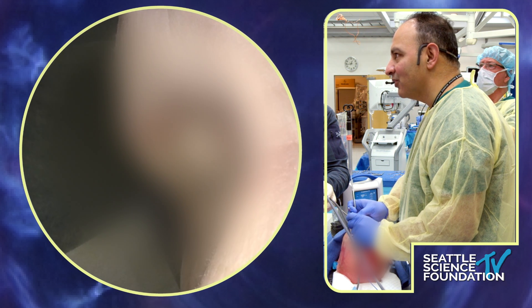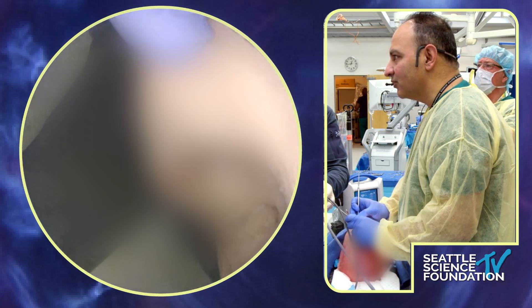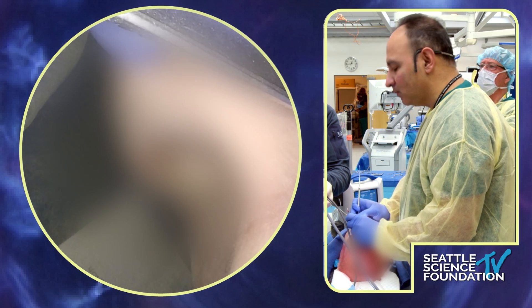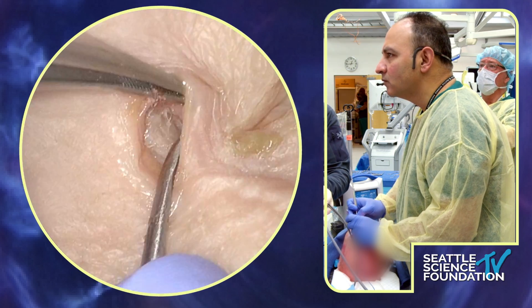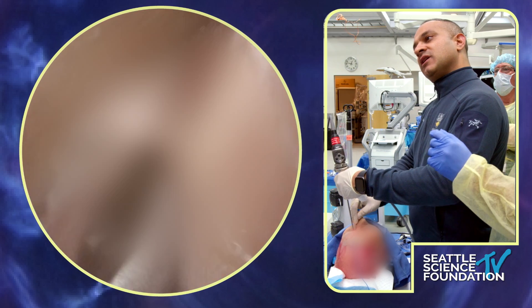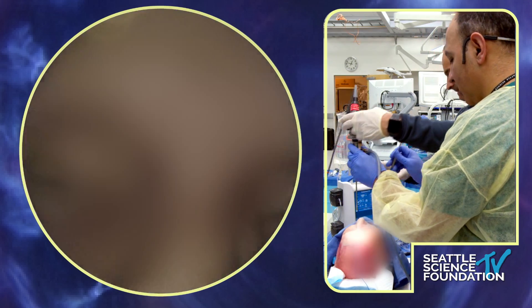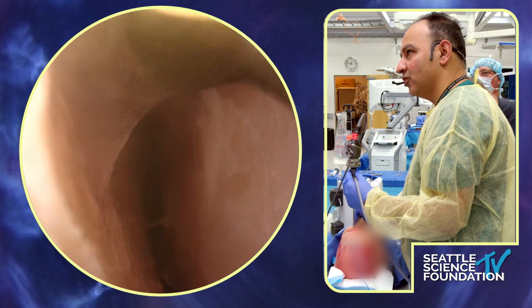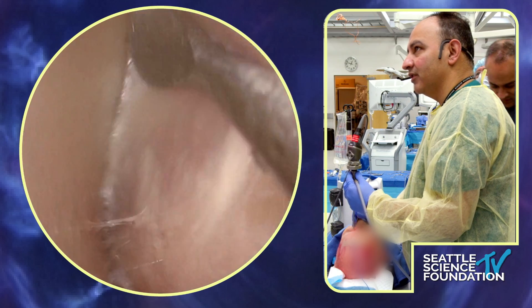As I get to this plane, there are some fibers sometimes that will give you a hard time because of the suture lines. This is also an approach you can do for anterior ethmoidectomy — remember the old external approaches for anterior ethmoid. There's sometimes a suture line here between the frontal bone. Remember the orbit is here, but as we saw in the navigation, the artery is going to be up higher. Let's see if we can identify it as we head back.